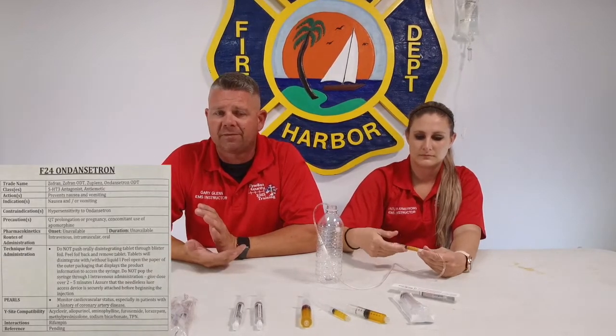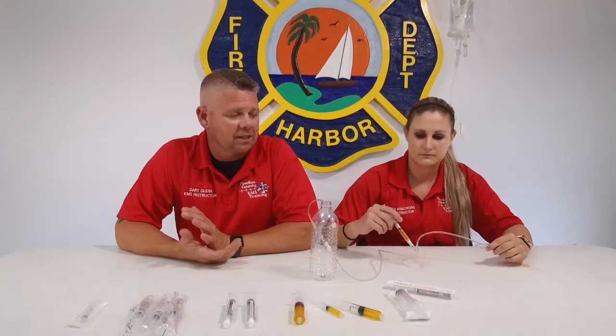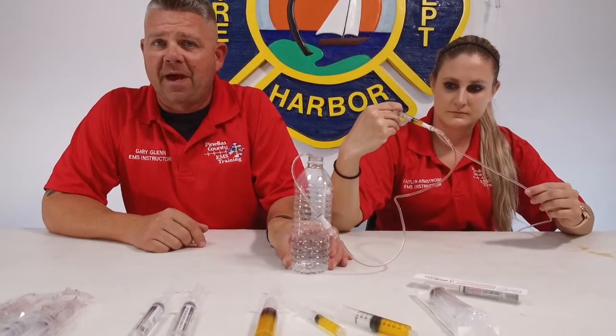And how fast do we want to give that? Well, we want to give that at a slow IV push rate, correct? So we're going to open up the IV line, make sure that we got a good flow, which we do. So we have a good flow going, and then as Caitlin pushes the medication, what we should see is the medication actually go down the line and not be pushed back up into the bag.